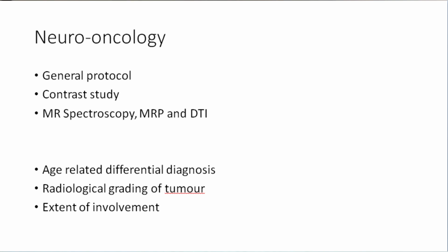So you can do those, okay, but when you guys report, please, please, please do give a differential. Nobody writes it. It's like there is a vasogenic edema, there is a swelling, there is a cystic component. How are you going to say this is a high-grade tumor on imaging? How many of the radiology residents know how to grade high-grade to low-grade tumor on imaging? I know 3 things about that on the imaging. Any of you know? Raise your hands.